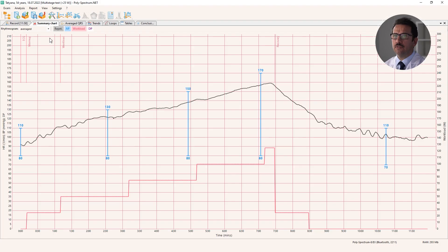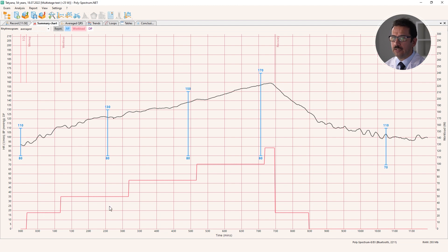Upon finishing the recording we proceed to analysis. The software automatically opens the first analysis window, the summary chart. The summary chart includes the chart of heart rate trend and exercise trend, and we can see blood pressure marks here. By default we see the averaged heart rate curve so we can see the overall trend.